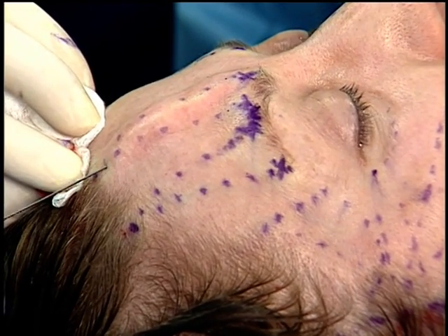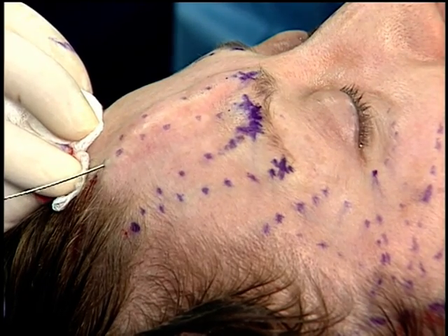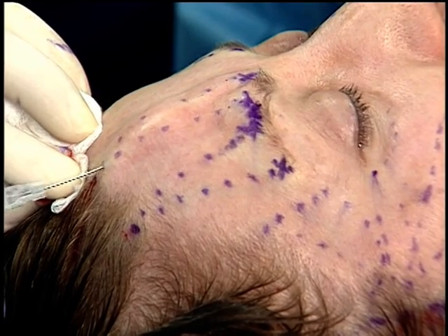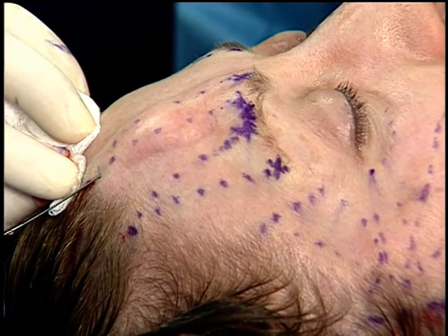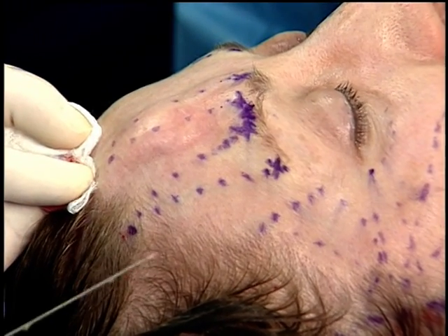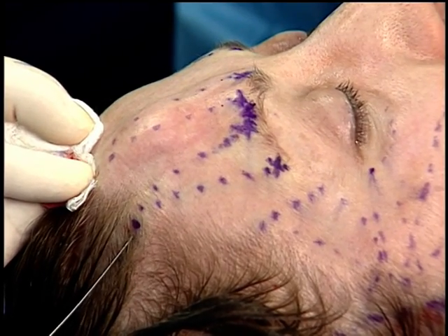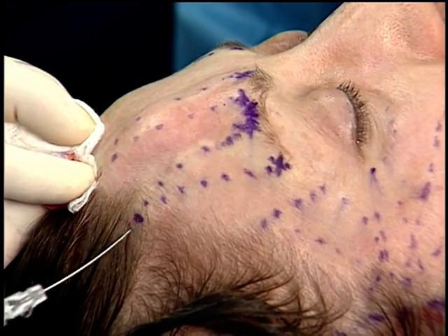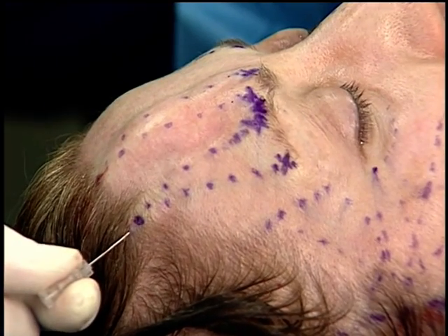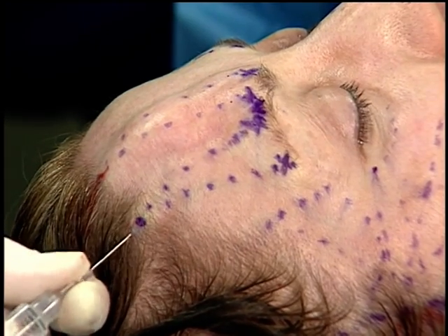Again, infiltrate, I'm in the fat plane, galeal or fat plane, a small amount as I advance. As I get down to the bottom, infiltrate a tumescent tunnel of about 2 to 2.5 cc's. So each track gets about 2 to 2.5 cc's of fluid. Again, hydrodissect on the way down. Make sure you're in that nice buttery fat plane, no resistance. Get down to the bottom. I'm going to switch now, and we're going to pull back, deploying 2.5 cc's of fluid.